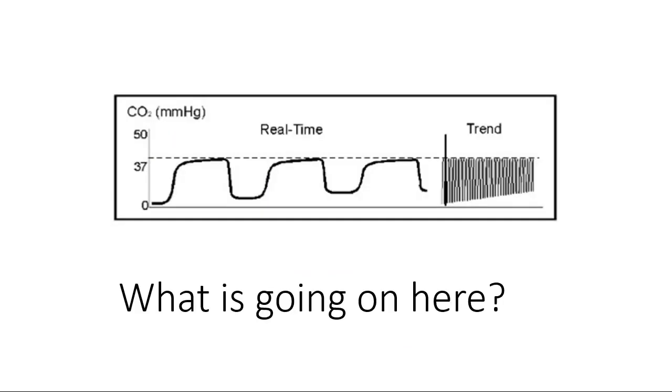So I want you to take a look here. Here you have a patient who's intubated, but you notice an increase in your baseline. An increase in your baseline, and you see that reflected in your trends. Now, do you remember what this is? Notice that you breathe in, but you never return to your baseline. You never return to zero during inhalation. So pause and contemplate.